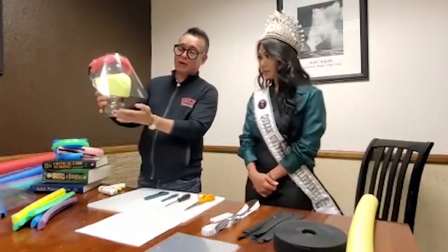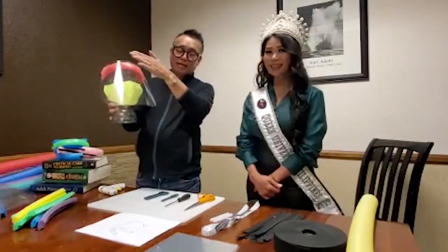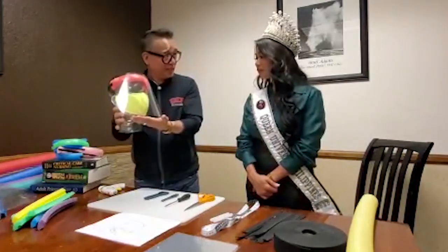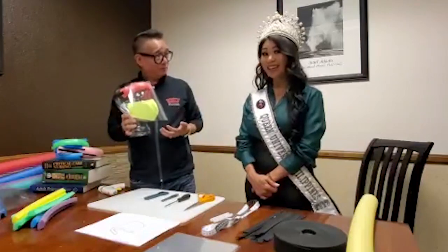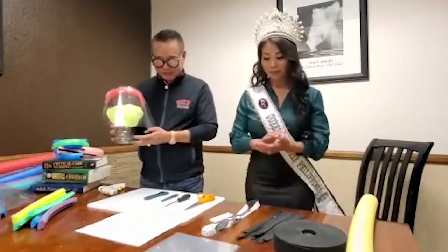So let's start with identifying material. But usually this is how it is. It actually has a foam in the forehead and covers the whole face of the frontliners. And not only that, each individual. And that's why it's very helpful. Stylish. Yeah, very stylish with the color. So let's go ahead and identify our materials.